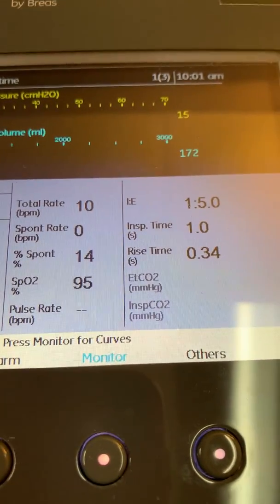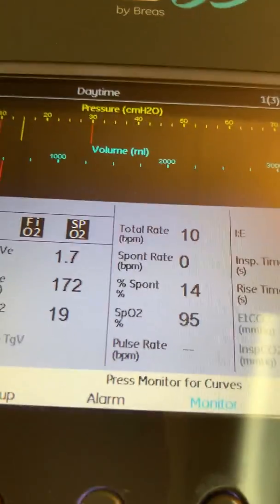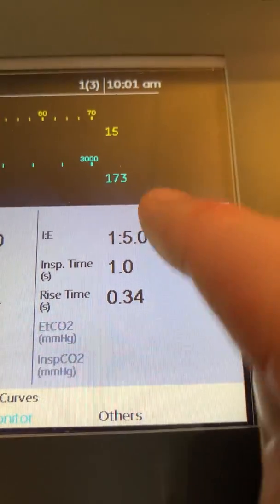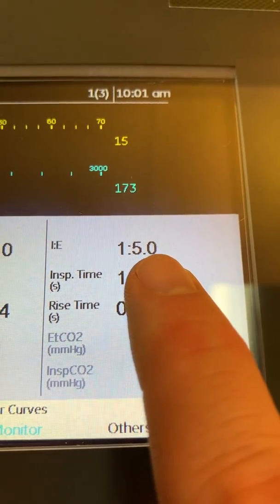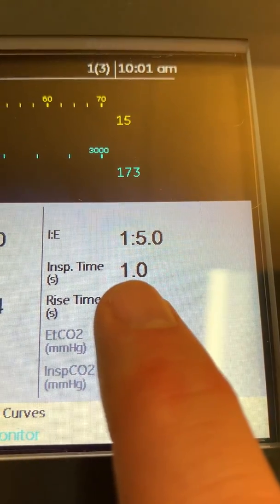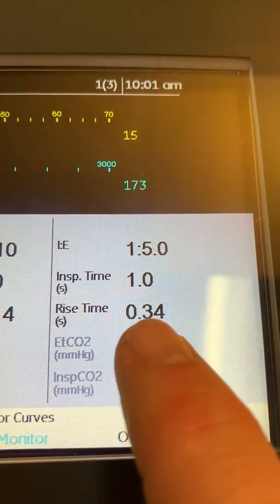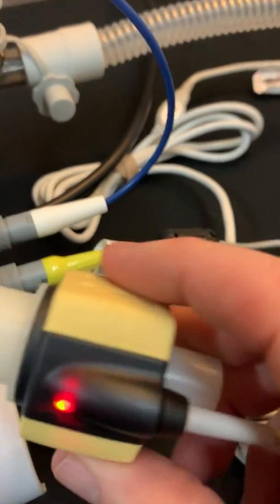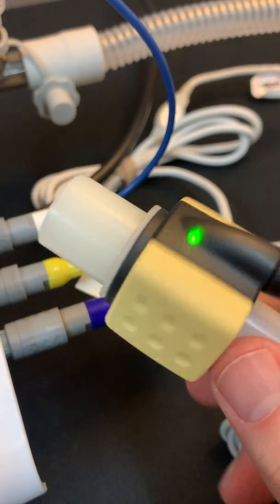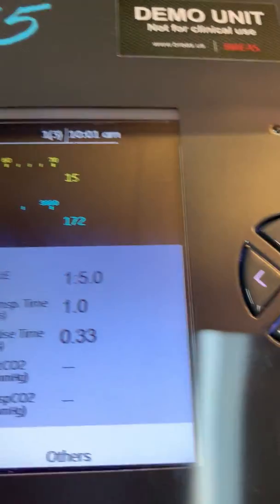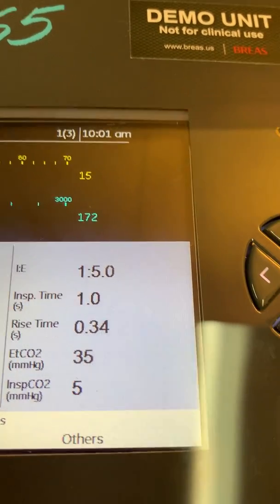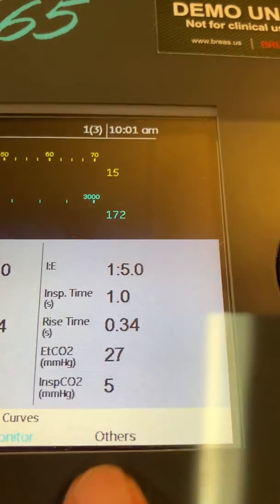After disconnecting the probe, in the last row there is a measured IE ratio, measured inspiratory time in seconds, measured rise time in seconds, and end tidal CO2 and inspiratory CO2. Connecting the end tidal CO2 sensor and blowing through it causes the end tidal CO2 values to display in the lower right-hand corner of the screen.